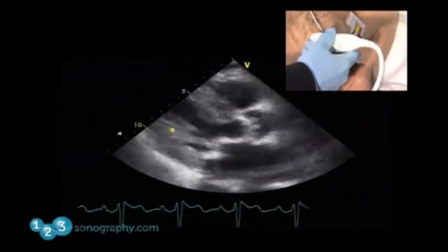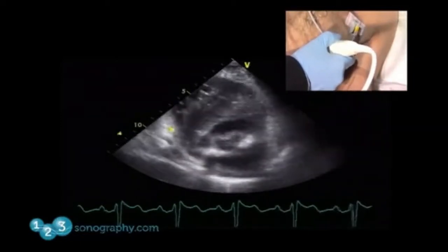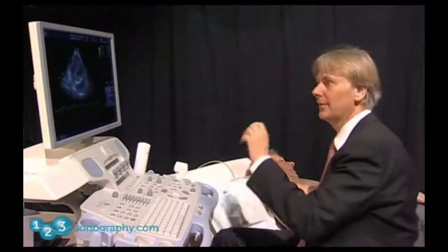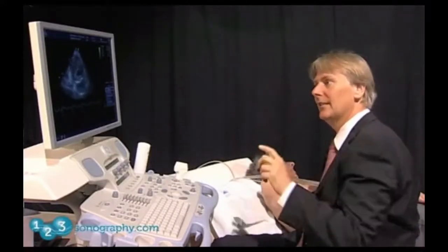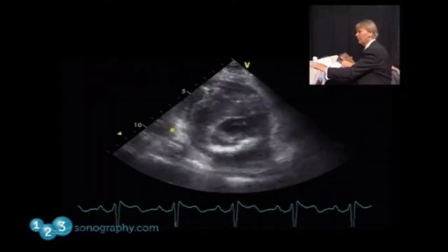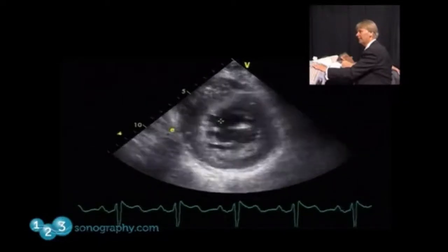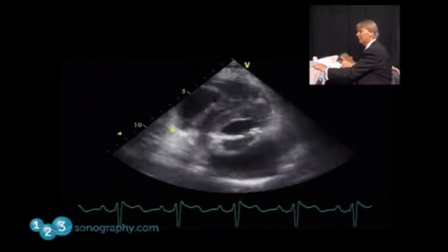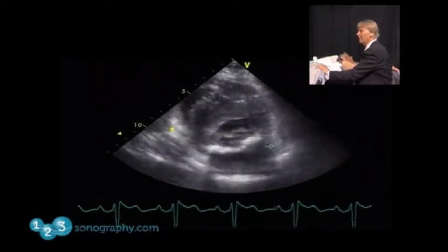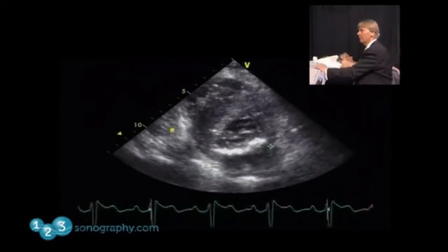The next thing I'll do is I'll just turn to the short axis view and we'll look at the mitral valve. So this view is very important because you can really appreciate the degree of calcification. You can see that the posterior circumference of the annulus is calcified, not as much the anterior circumference where there's actually almost no calcium or little calcium, and that the valve itself is opening quite nicely. The opening is reduced. We can even do some form of planimetry here.